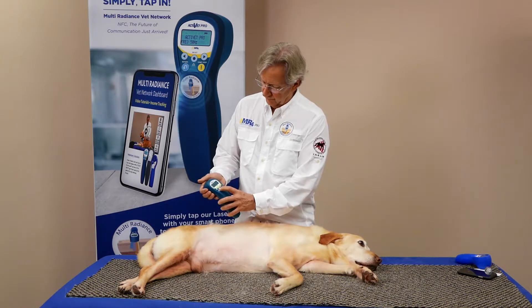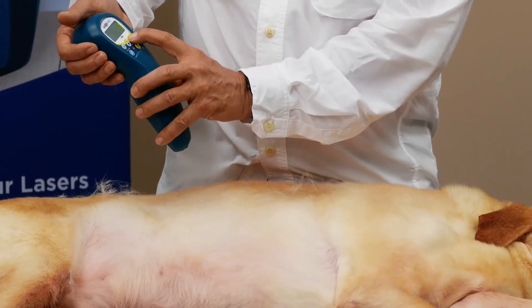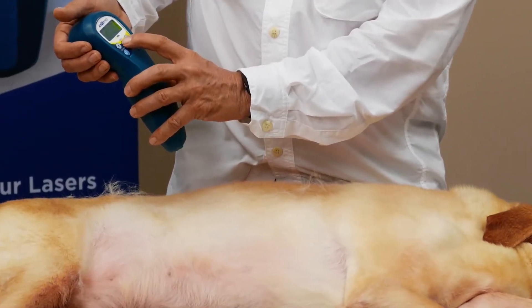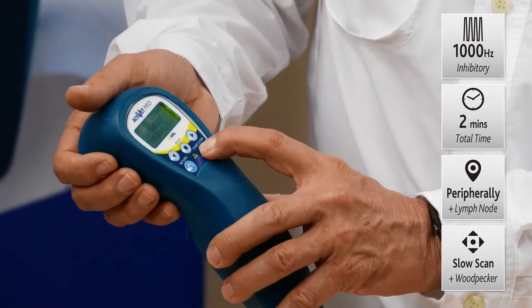On the ActiVet Pro, press select, and for the frequency setting, use 1000 Hz, press select. Two minutes is plenty of time, and then just push the power button.